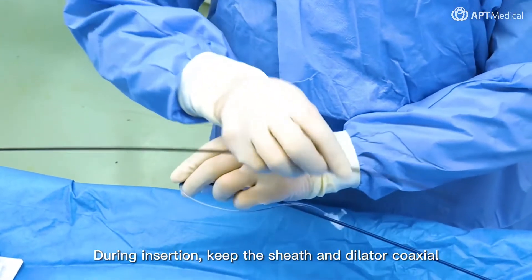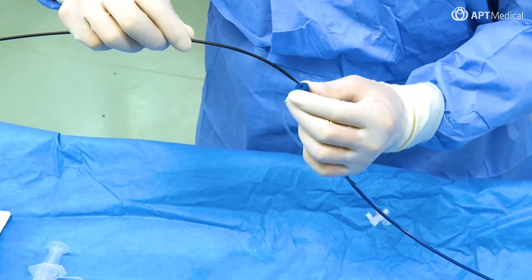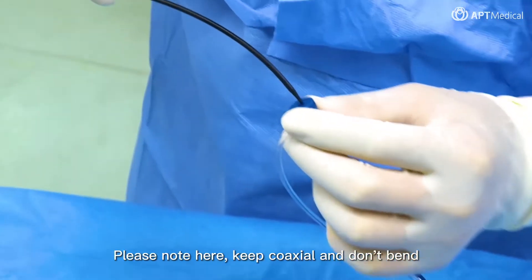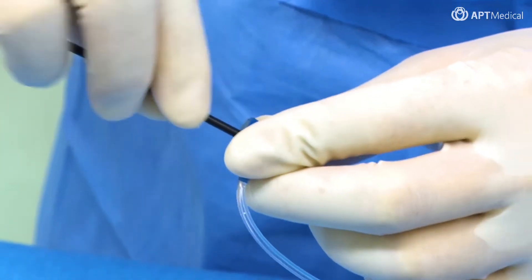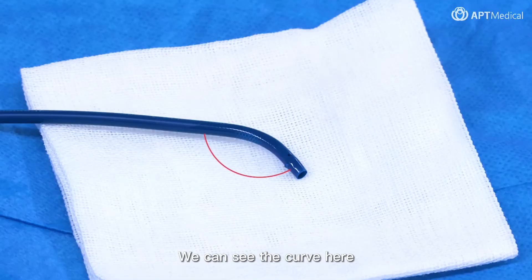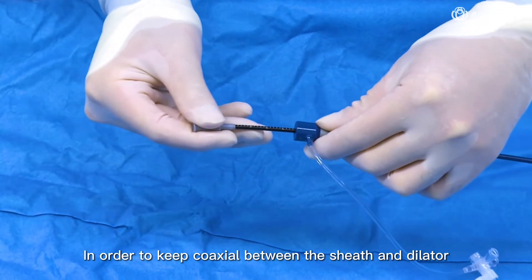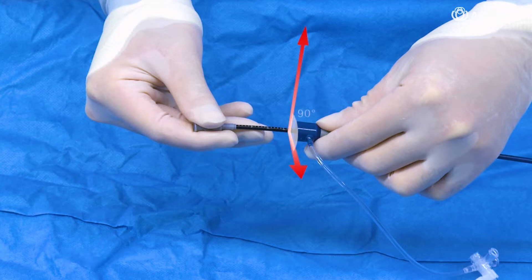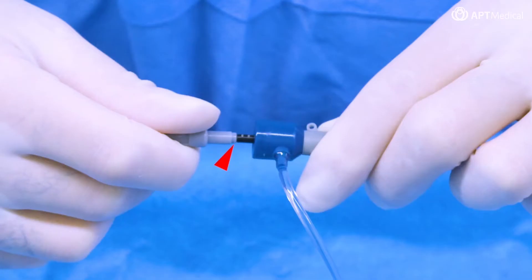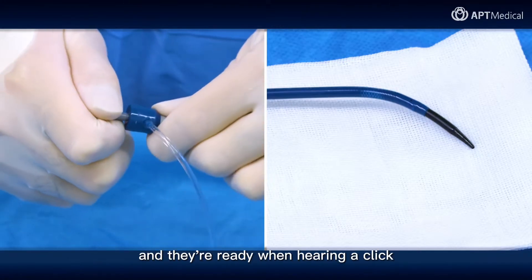During insertion, keep the sheath and dilator coaxial. Please note: keep coaxial and don't bend. When coming to the distal part of the sheath, we can see the curve here. In order to keep coaxial between the sheath and dilator, make the scale on the dilator vertical to the side port of the sheath. Push to ensure a successful assembly of sheath and dilator — they're ready when hearing a click.